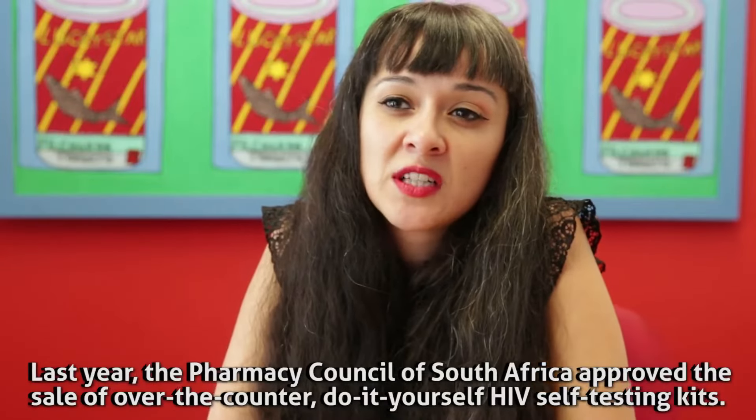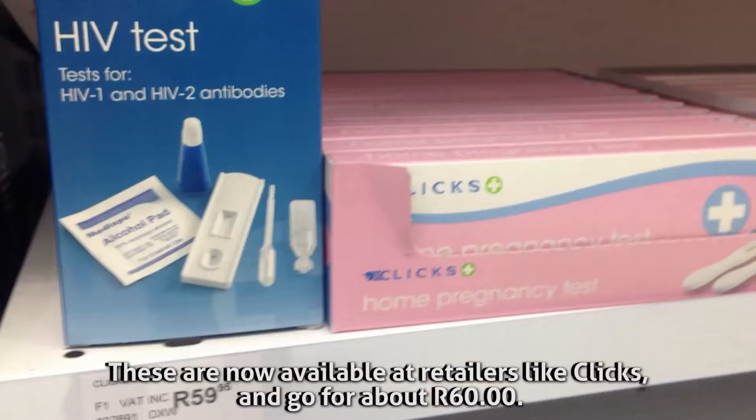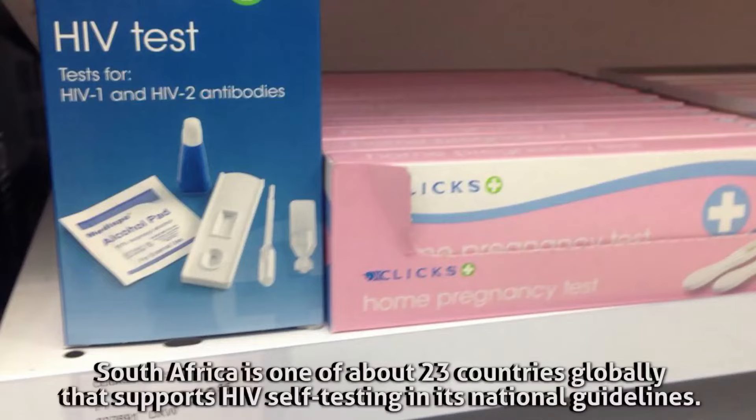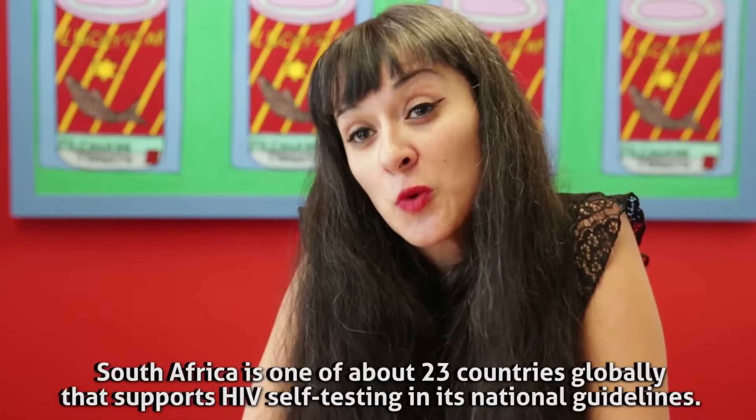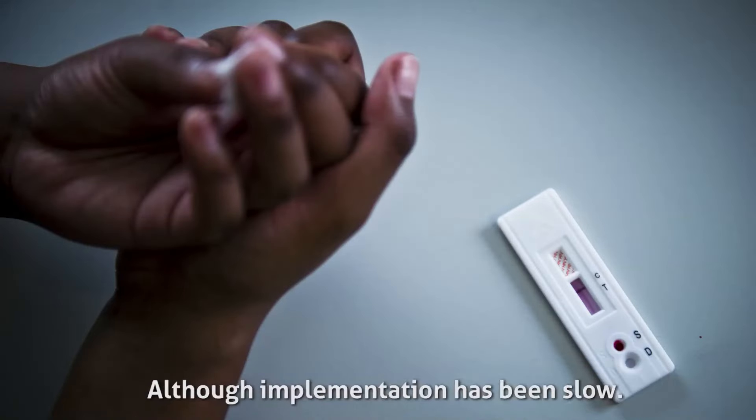Last year, the Pharmacy Council of South Africa approved the sale of over-the-counter, do-it-yourself HIV testing kits. These are now available at major retailers like Clicks and go for about 60 rand. South Africa is one of about 23 countries globally that supports HIV self-testing in its national guidelines, although implementation has been slow.